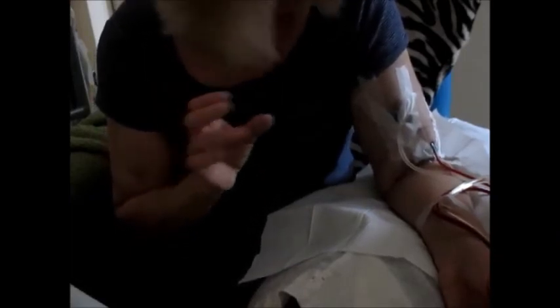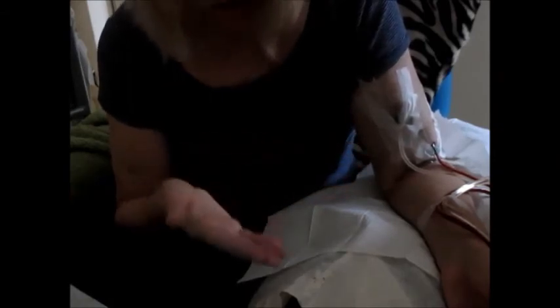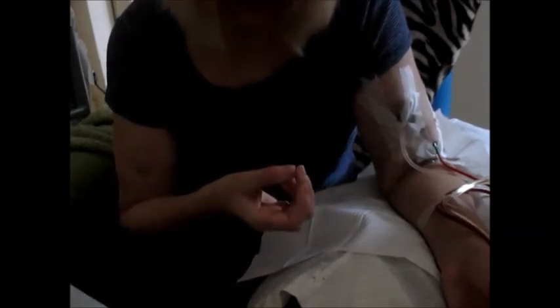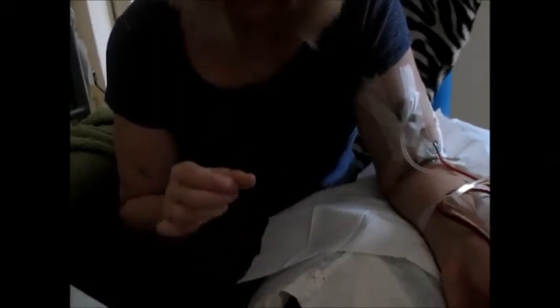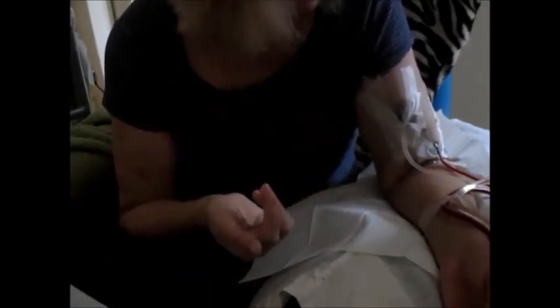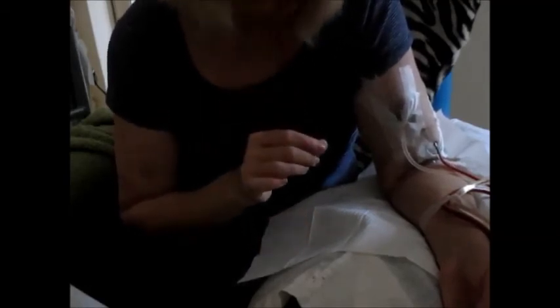Another tip: I always make sure my recliner chair — which has a recline facility with a hand control — is far enough forward away from the wall. Should I become lightheaded during treatment or my blood pressure starts to drop, I can then lie myself far enough back and check my blood pressure with the remote control. I always monitor my BP throughout treatment. I check it ten minutes after treatment starts, then about an hour after, and then about halfway through. If I started to feel lightheaded and unwell, I would reduce the UF goal — i.e. how much excess fluid I'm taking off during treatment.